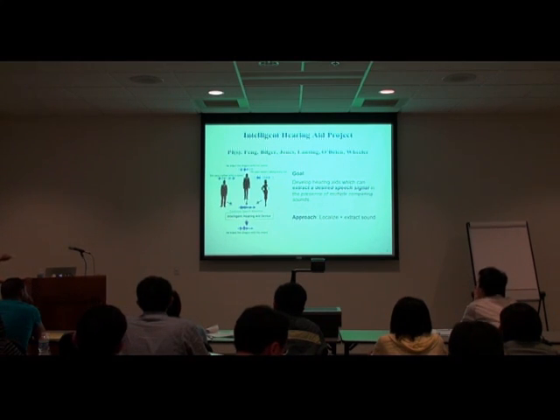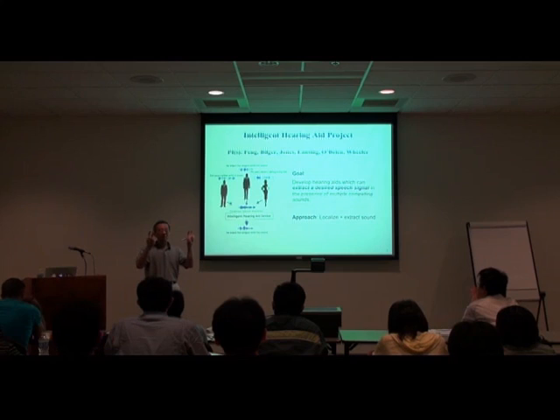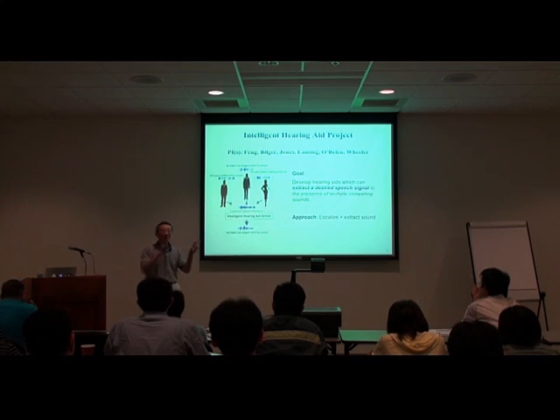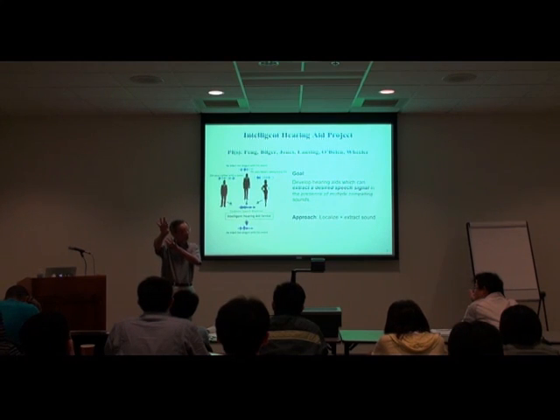What we want is just the individual input rather than multiple. I think the strategy in the biological system typically involves what we call localization first. When you locate, just like when we're doing attentional hearing, you precisely say, I want to listen to that, either by the sound characteristics from that individual or by the location of that individual.